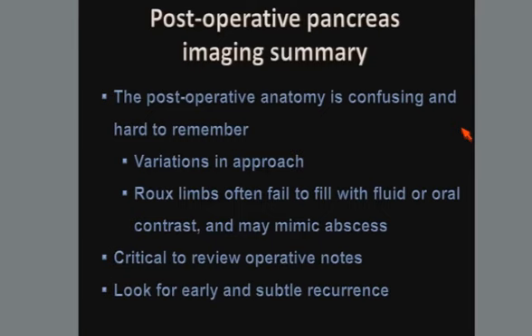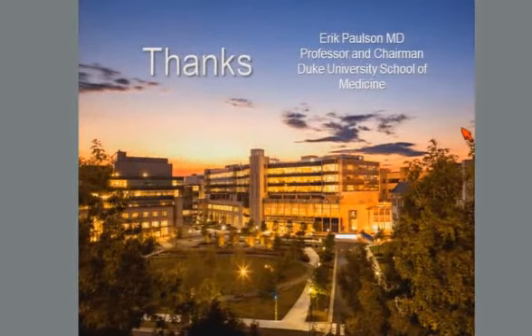I find it critical, as Dr. Cannon pointed out, to review operative notes and the medical record to try to figure out what a surgeon has done. Even if you do that, it can be difficult to figure out what a surgeon has done, and in the more remote setting, look very carefully for subtle recurrence.